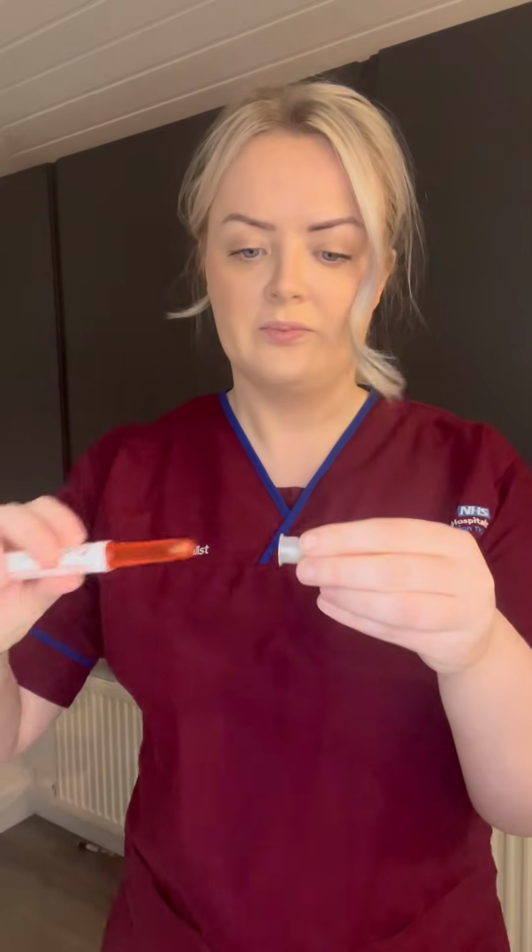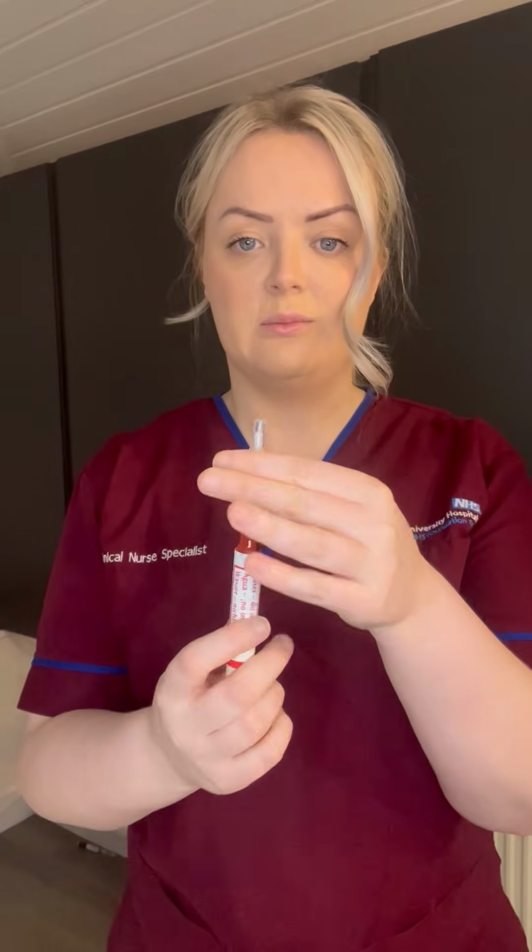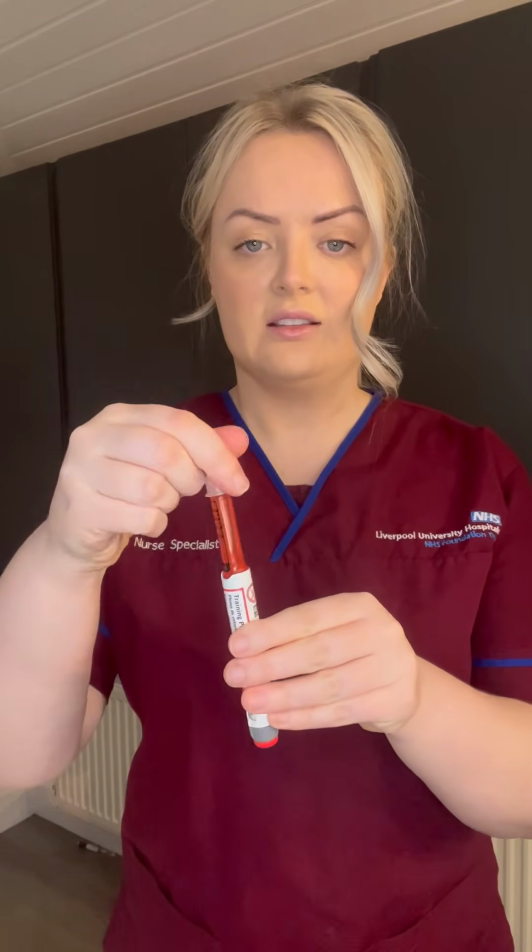So these would be the types of needles that the patients would use if they were going to administer it themselves. So you can see it looks very similar. You peel off your cap as such, screw it on to the end of the pen until it's locked in position, take off your first cap and then your second cap, and obviously you can see there this tiny little needle, and obviously that's an exposed needle, which is why as a healthcare professional we would never want to use that, as there's very high risk of sharps to us. But if patients were using it themselves, that's perfectly safe.